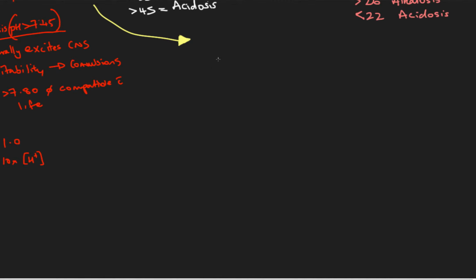Okay, and then what I mean by the non-affected component is, is there any effort by the metabolic side to try and pull that pH back towards normal? Is there any effort from the bicarbonate concentration to perhaps pull the pH back towards normal? So what we mean by compensation, let's put a little squiggle around this.